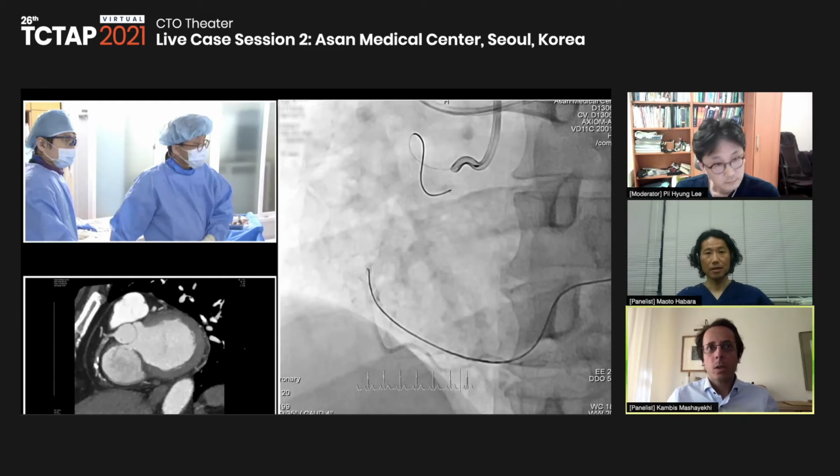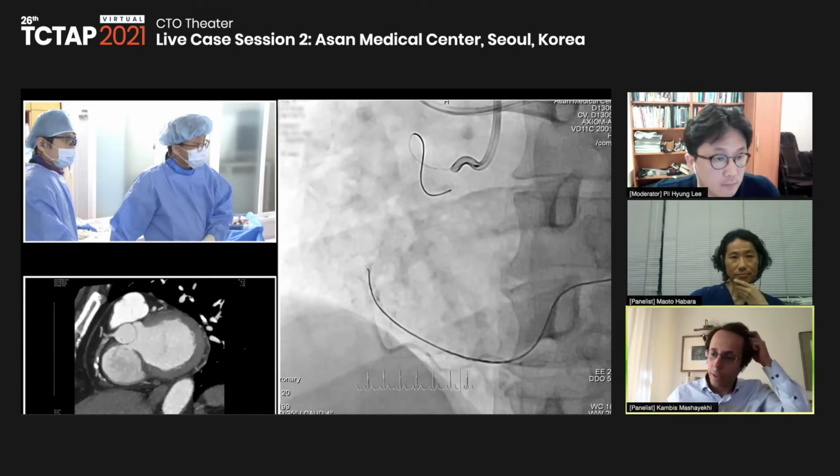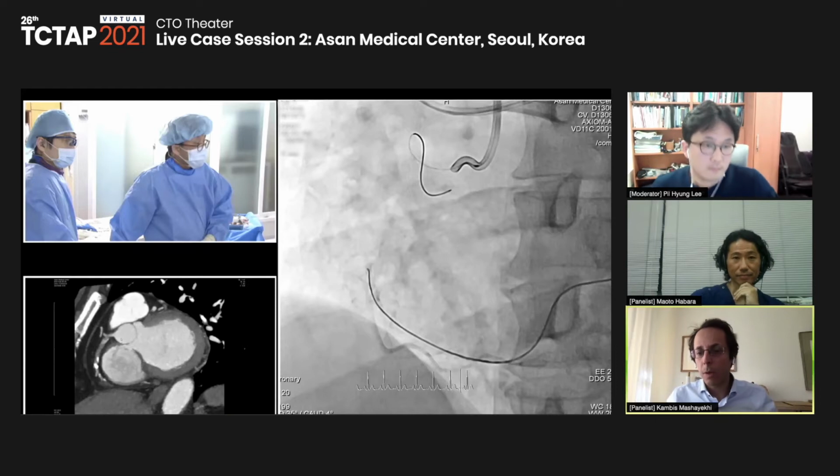And another was from Taiwan, from Huang, where Paul Kao was the senior author. So the Huang score, I call it like this. It's a very simple score. When you have a really big epicardial, CC2, and no tortuosity, you already have 3 points, and the chance of passing is very high, up to 90, 95%.